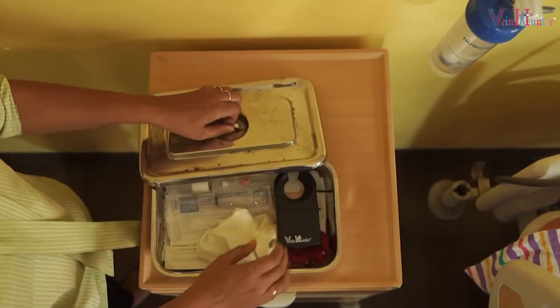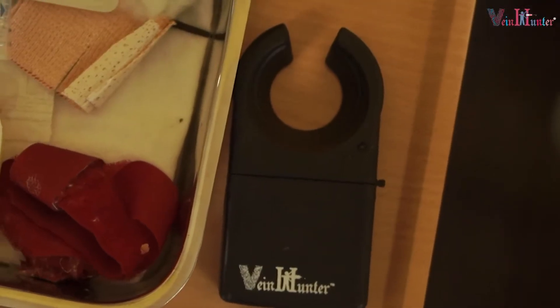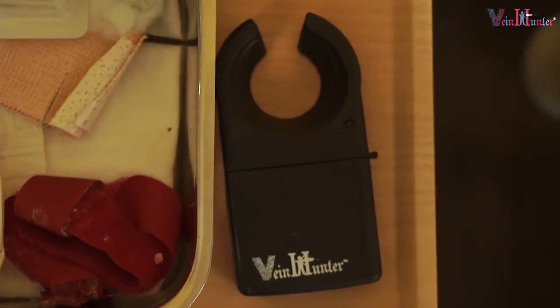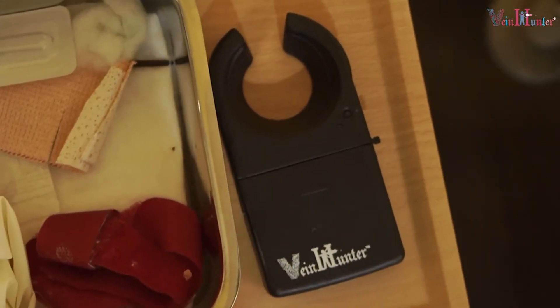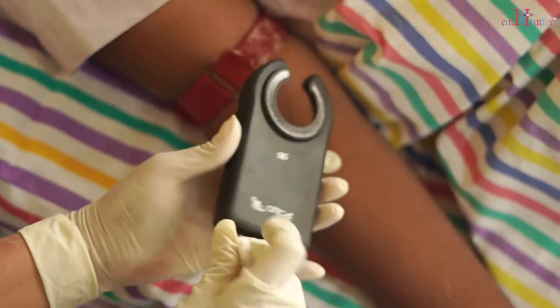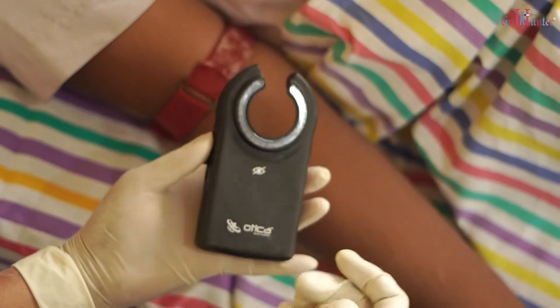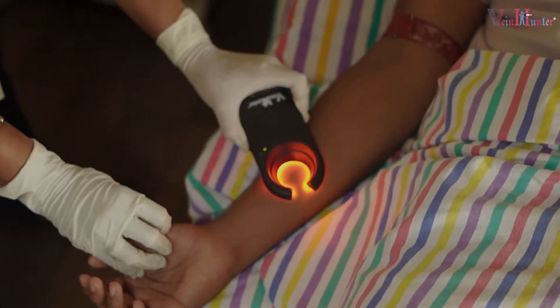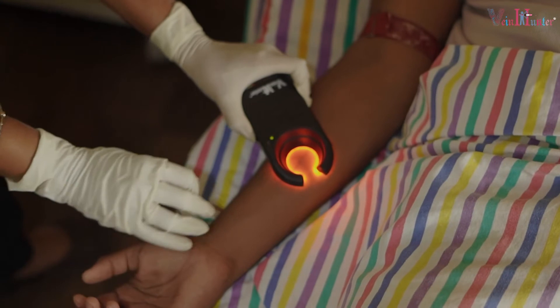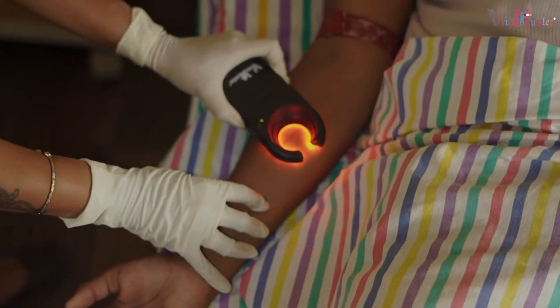This is how you can use Vein Hunter Otica. Before using Vein Hunter, make sure the machine is properly charged. Now wipe the area of the machine surface with an alcohol swab to prevent cross contamination. It is recommended to switch off any overhead fluorescent light, as this might interfere with the vein illumination.